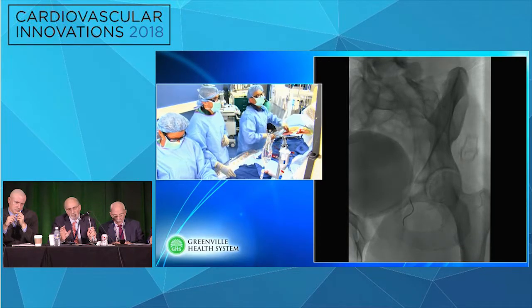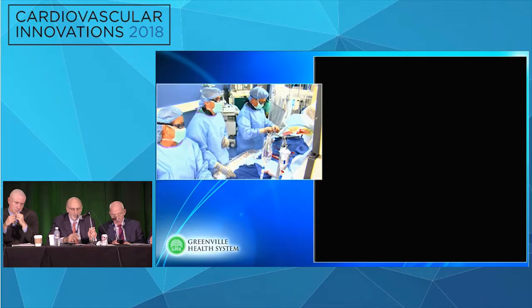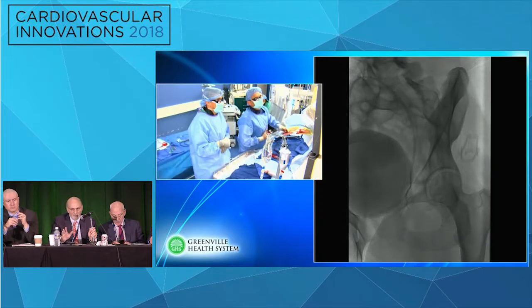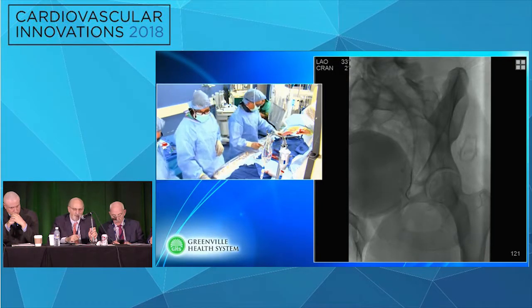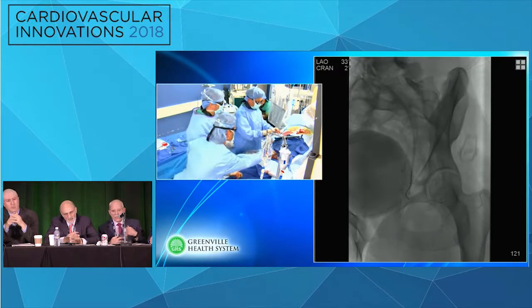Which is fine. But I think in terms of where you end up putting the stent, you can balloon dilate that whole area. But you can see what happens when you balloon dilate it. You end up with a spasm and so on as you did. In terms of where to stent, I think if you stent into any of those branches, profunda or femoral, then you're going to end up compromising your inflow. So I probably would stent from halfway up the femoral head, and that's it. But that's just me. I don't know. That's my mindset too, Kenny. I agree with you there.